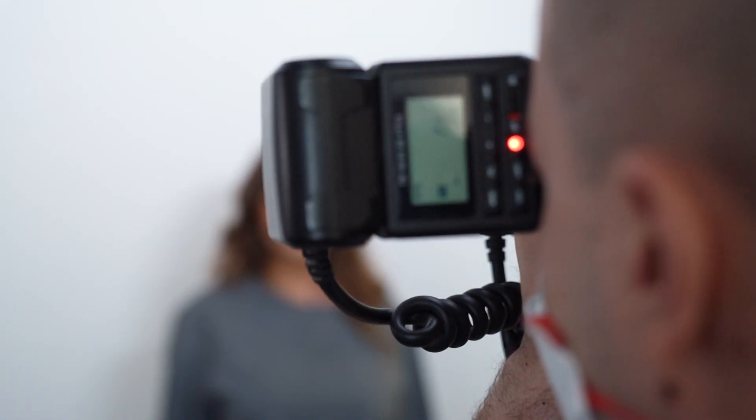Let the patient stand in front of a white or blue background to get the right exposure. Start with the frontal view, making sure the patient's eyes are looking straight into the camera with their head straight. Once done, ask the patient to smile naturally, keeping the same head position. The last extraoral shot is the profile, where you ask the patient to turn to their left and look straight ahead. Make sure their ear shows in the photo.